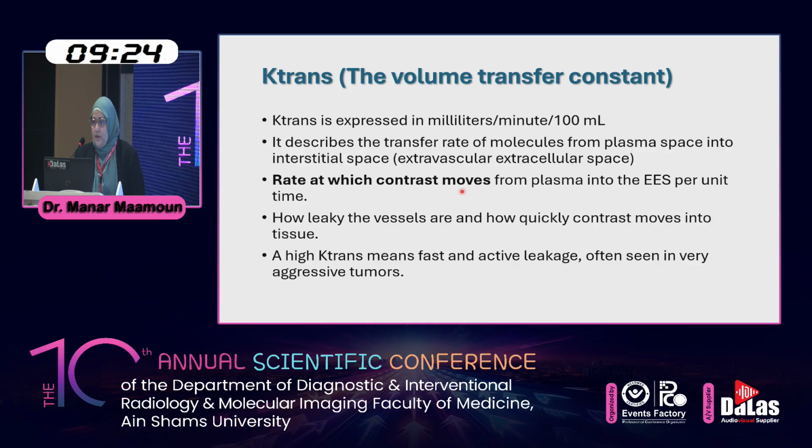It is similar to normal contrast enhancement, where the vessels are leaky and the contrast passes through tissues, but we are not assessing its timing. With K-trans, we assess how quickly the contrast leaks from the intravascular to the extravascular compartment, while with the usual contrast enhancement, we assess the presence of leakage, not in a timely manner, so they are different.